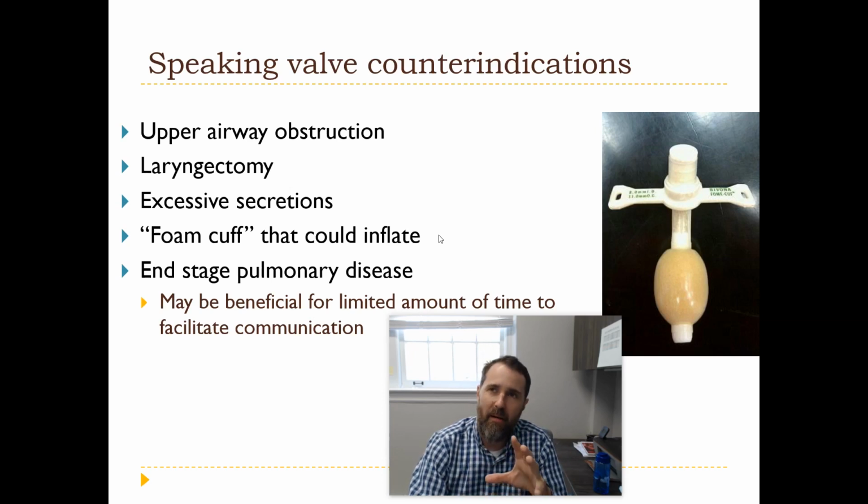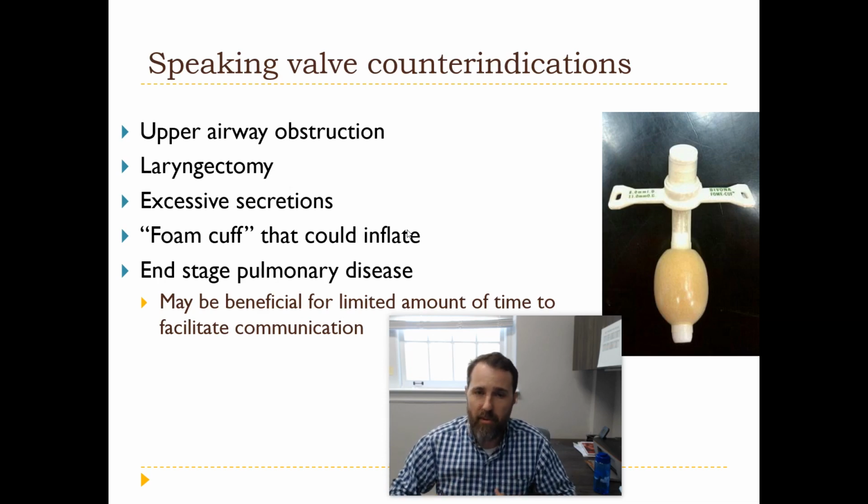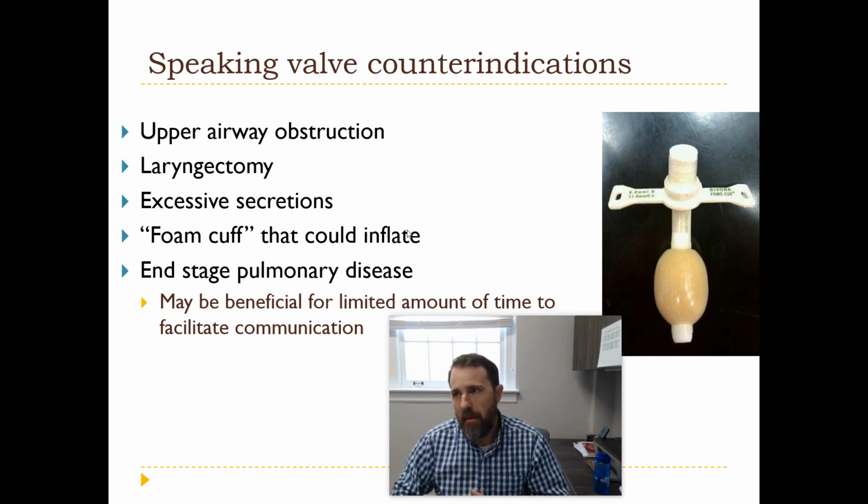And you have to think about the careful placement of speaking valves on anyone that has some end-stage respiratory illness, because it is going to possibly make respiration more effortful.